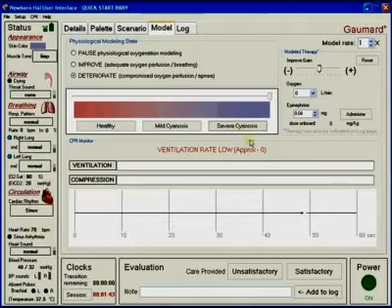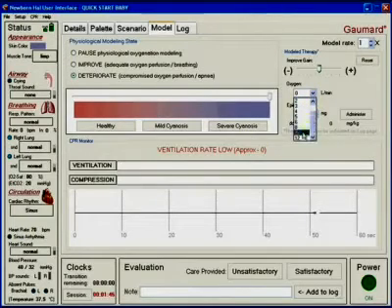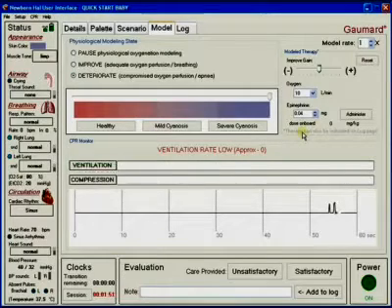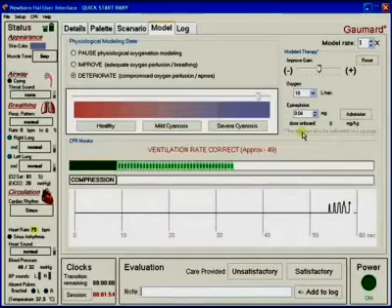Once the providers initiate adequate ventilations, all of the vitals will respond. Heart rate and oxygen saturation will increase and cyanosis will decrease gradually.